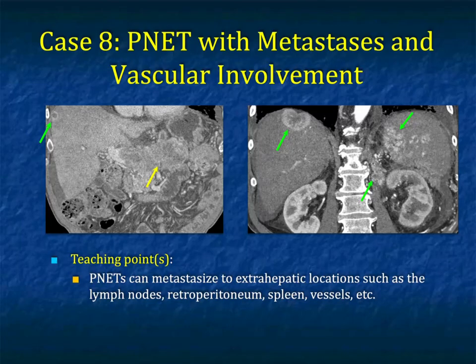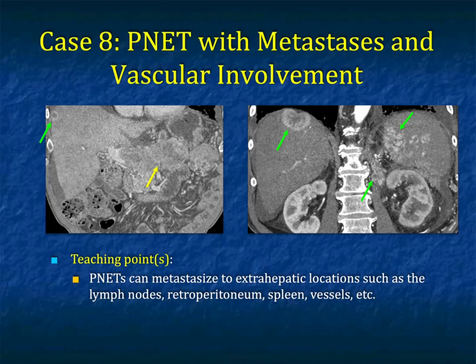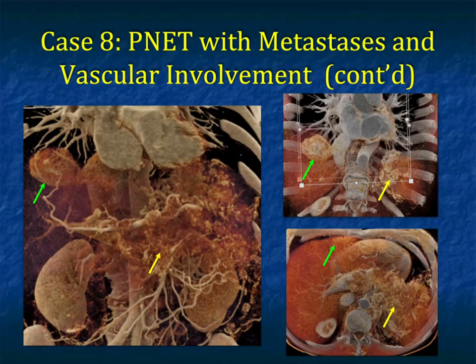Case eight: a patient with neuroendocrine tumor with metastasis. There's vascular involvement — the tumor is growing into the lymph nodes, the retroperitoneum, the spleen, the portal vein, the splenic vein, and SMV. You can very nicely see the multiple vascular metastases. Cinematic rendering defines the neovascularity, the tumor, and the extensive vascular extension by the splenic vein, portal vein, and SMV — very nicely shown, particularly on the right-side image.